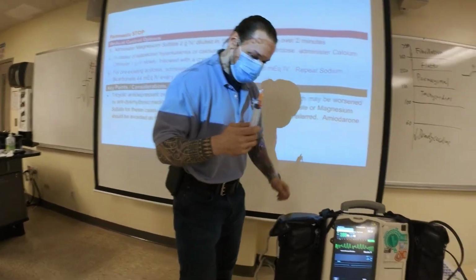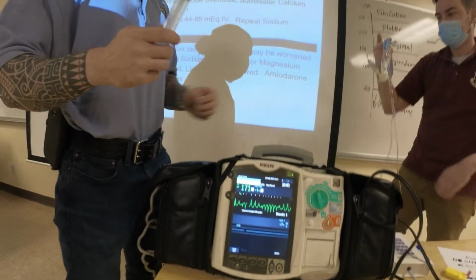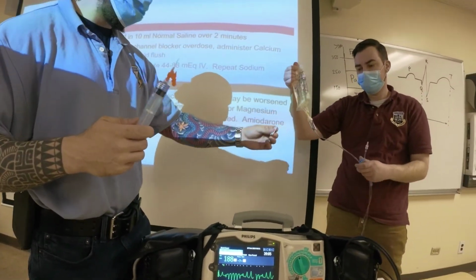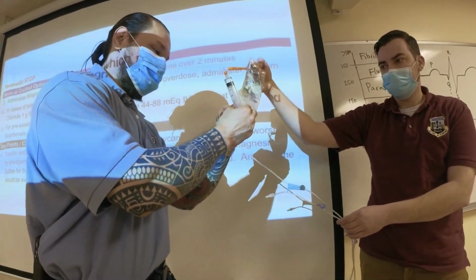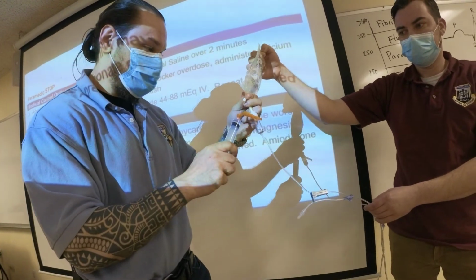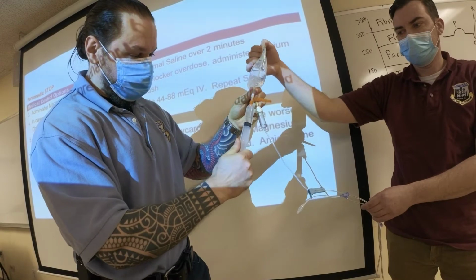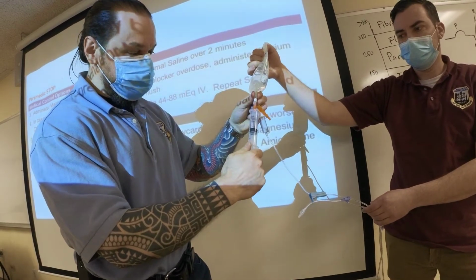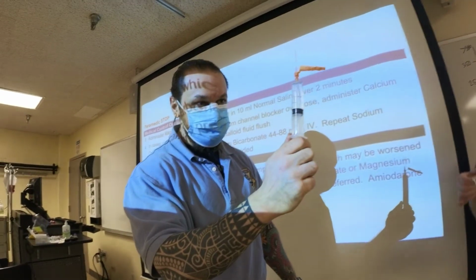All right, so Georgie, come over here. That's why I said never bolus your drugs. Always put a line on them in case you need to. So you see the port here. This port is for what? But I'm not giving medicine, so what am I going to do? Draw out of it. How much? You could draw a little bit more, right? So I had 14. I'm going to put 15, right? So I have 15. Close the mag.